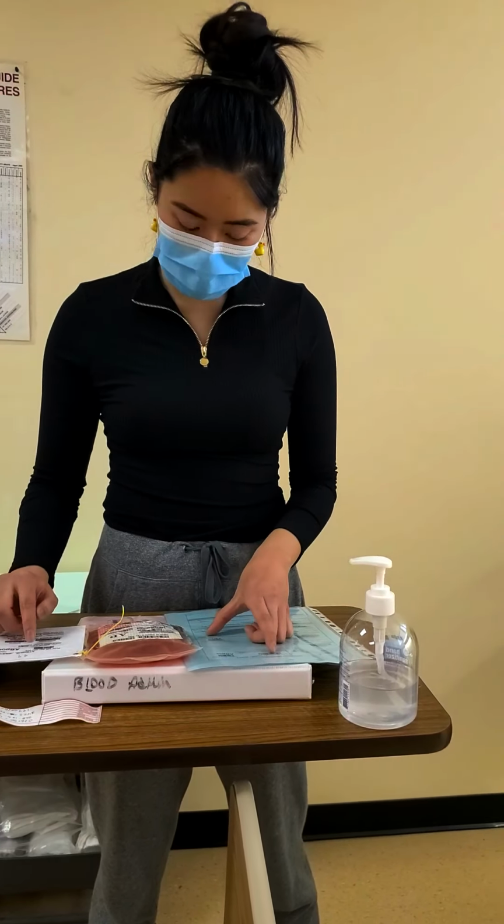Okay. So now that that is finished and our nurse has verified that, we can now compare the blood bag with the blood tag. So we have our product. It's red blood cells, you can see here, and red blood cells. We also want to take a look at the donor's blood group. So it's AB positive and AB positive. It's compatible still. And we're going to take a look at the donation number. So it's C051008900-445, Y in the box. And she verified that it was also correct there.